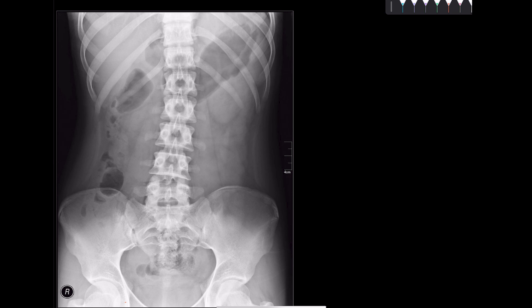Dear viewers, today we will be learning about interpretation of an x-ray abdomen — how to approach the abdominal x-ray. It is essential to have a structured approach when examining an abdominal x-ray. This ensures that all aspects of the image are assessed in a comprehensive manner, and the acquired information can then be integrated into the clinical scenario to proceed to a logical diagnosis.